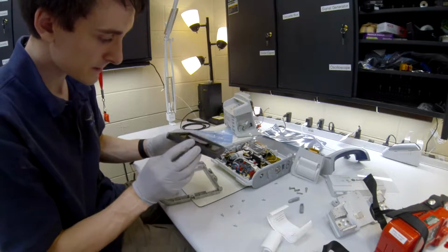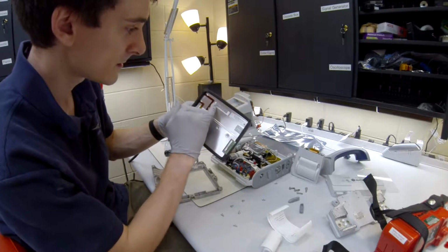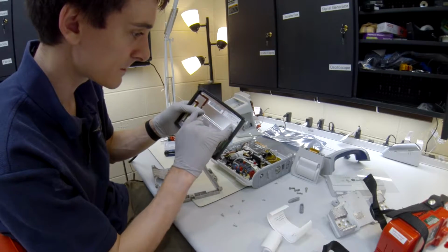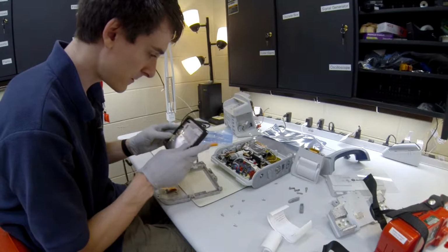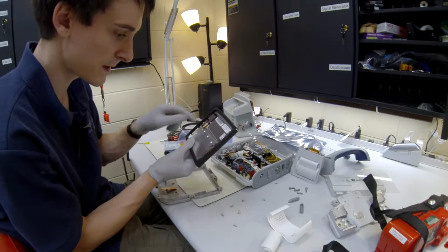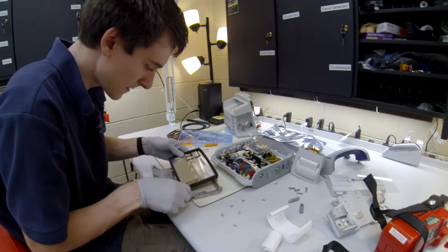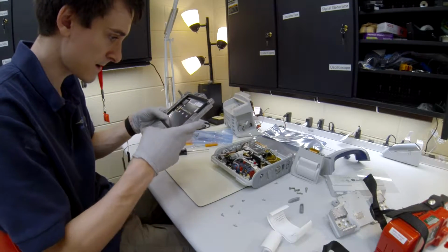Alright, so we got it back into the little rubber piece that it was in. So the serial number as well as the model number, all the stickers are going to be facing the way that you look at them. They're not going to be upside down like this. So your ribbon cable is going to be poking out of the side here on the bottom piece. We're just going to put that right back in right there, just like that.